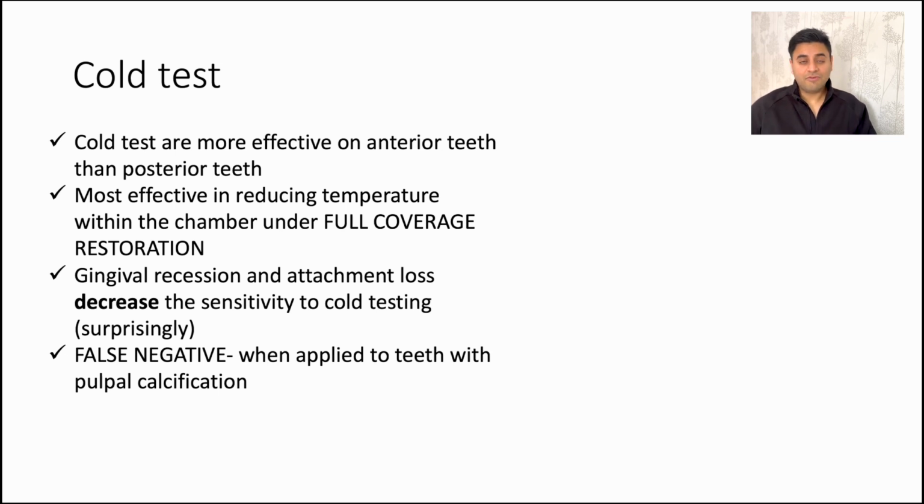And next is, when do you get a false negative and a false positive on a cold test? A false negative is when applied to a tooth with pulpal calcification. If the pulp chamber is calcified, there is not much nerve tissue present in the pulp, because there is no pulp, or it's calcified. So that cold sensitivity will not be conveyed to our nervous system, so we might not feel it much. So it may give us a false negative when applied to a tooth with pulpal calcification.